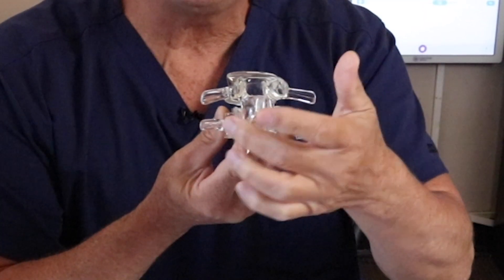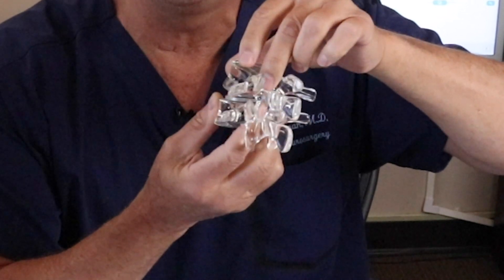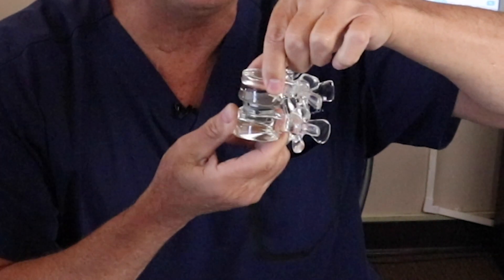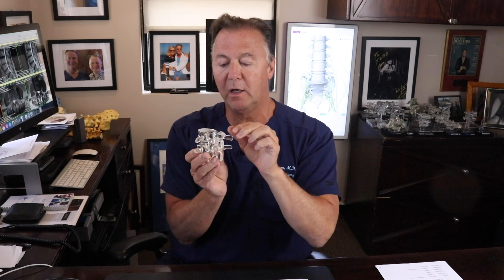What's very important is that the joints in the back of the spine need to be relatively healthy, because the spine still moves with an artificial disc — you can see the joints still move. It's a ball-and-socket; it rolls around. You replace the center disc, and the facet joints in the back move in conjunction with the core. That's how they all work.